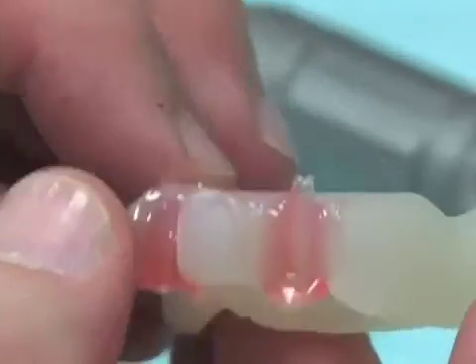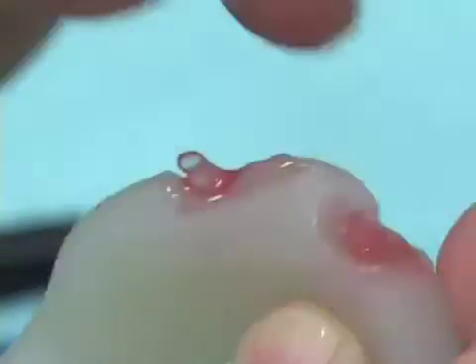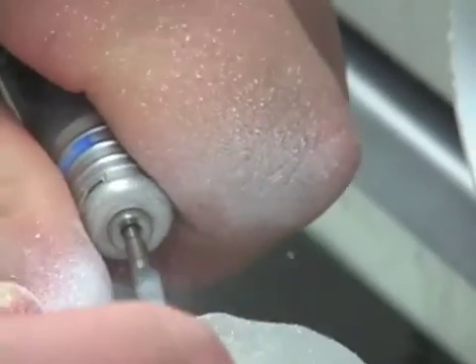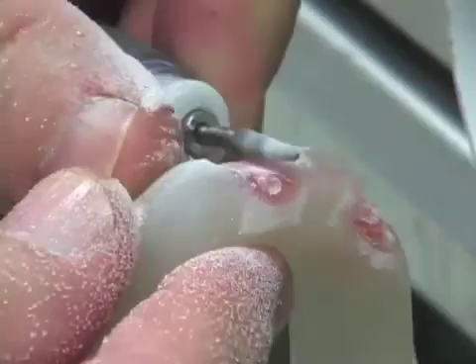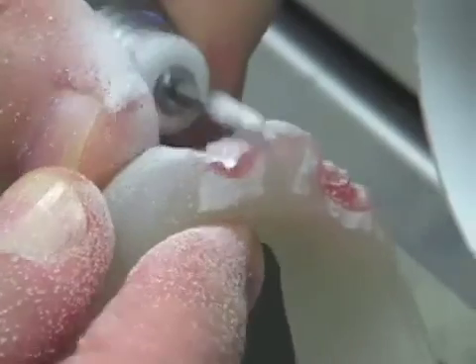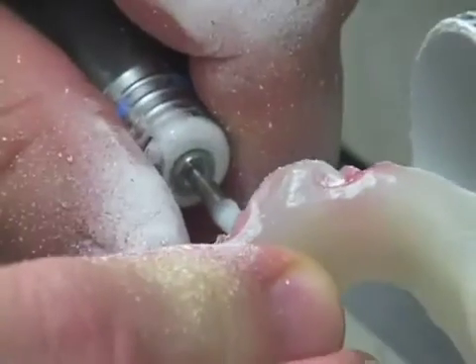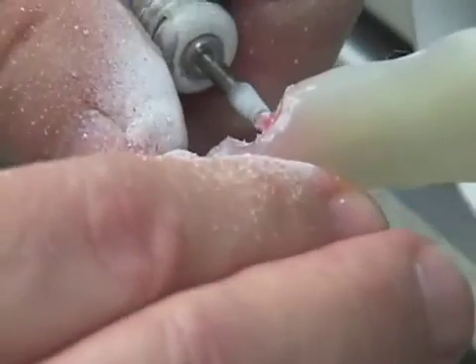Now what we want to do is trim these so that we have free access from the buccal or labial aspects. We trim the occlusal aspect. I trim the cervical aspect of the drill guide. And also trim the buccal or labial until I break through or expose the channel that's left by the drill blank. Once I've exposed the channel, again, I just carefully trim the sides.